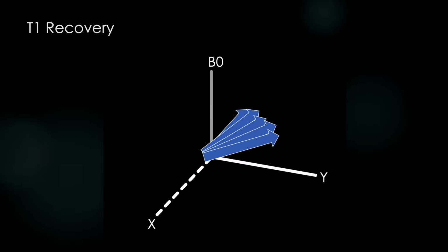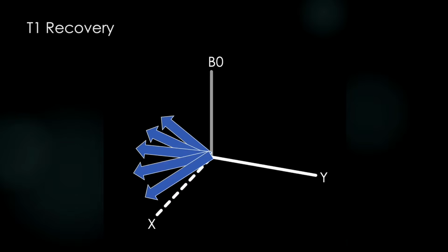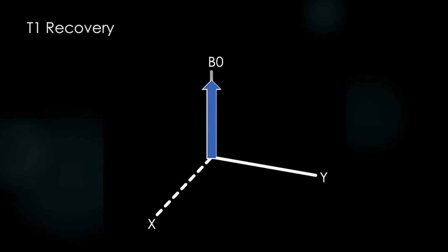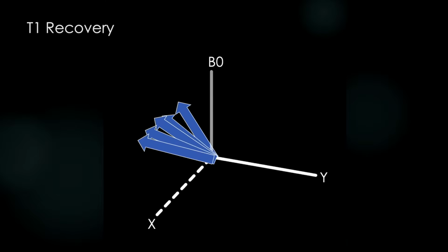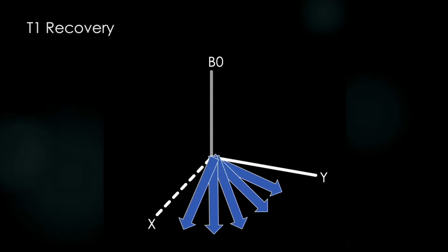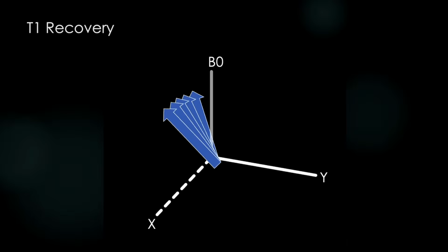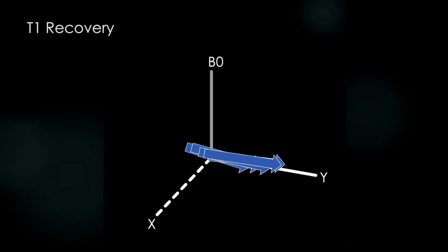This graphic intends to show you that, from our resting state with our net magnetization aligned with the B0 or z-axis, same thing, after we knock this into the XY plane with our RF pulse, it starts dephasing as time goes on, which is true. This is the decay of our T2 decay curves. We then induce another pulse to flip these protons 180 degrees, shown here, at which point they begin to rephase, perfectly realigning back along B0. My question to you is, from all we've learned so far, does this make sense in terms of current being induced in a coil?